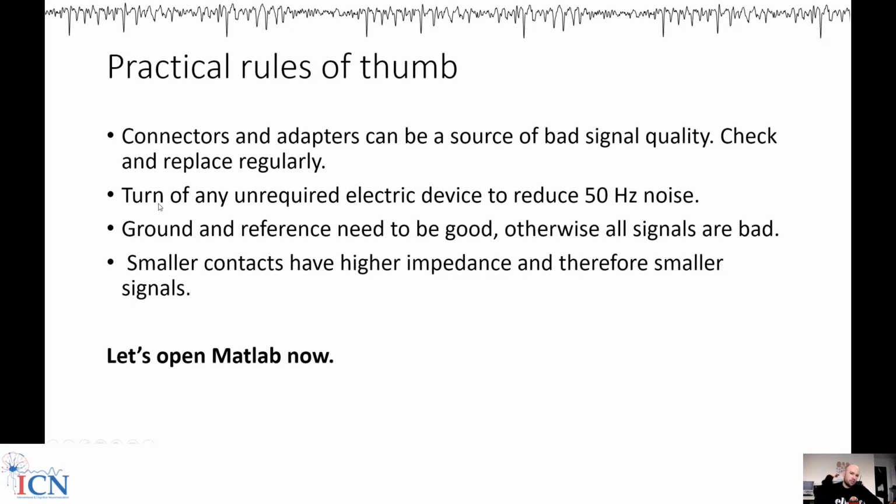We use patch electrodes on the shoulder of the patient, but often hand, arm or wristbands can also be good. If you get a bad signal and your reference is good, try again to wet the ground or try a different ground electrode. That has often rescued the signal for us.